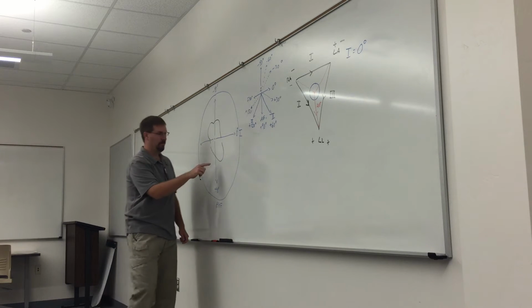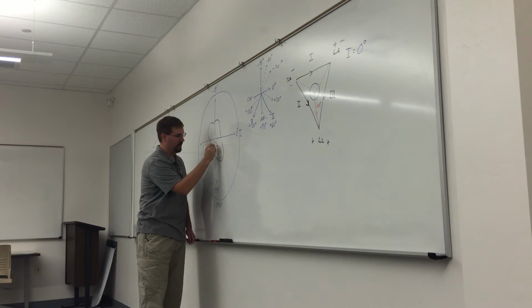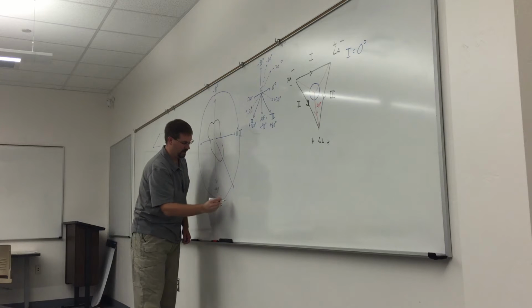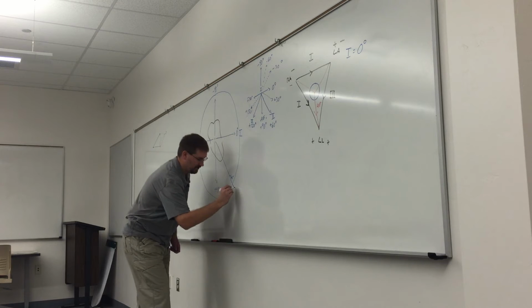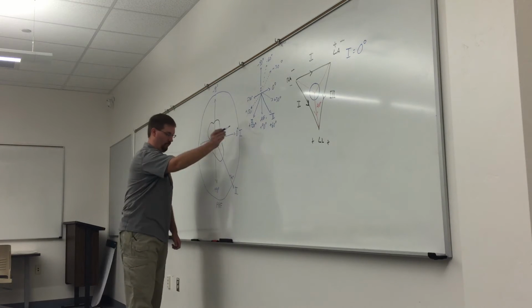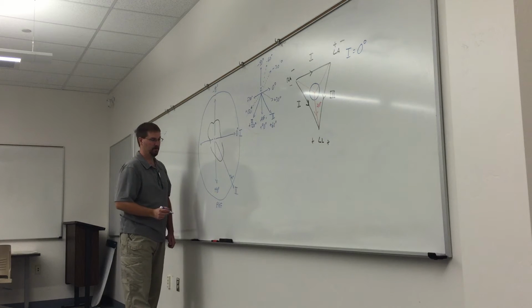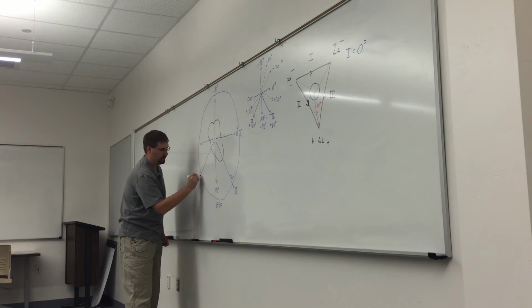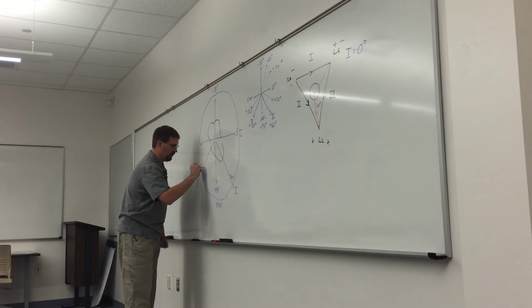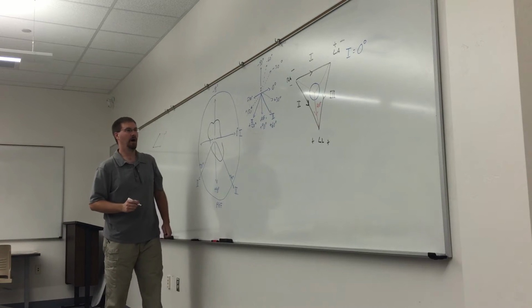Where's lead 2 here? 60. All right, so it's going to be a little closer than 90 here, so let's draw that. You guys cool with that? We're going to say that this is +60 degrees, and this is lead 2. All right, so I have 1, 2, AVF, and what's the other lead that we want to talk about a little bit? 120. Right, 120, which is going to be a reflection of this one here, and this is going to be 3. And that's 120 degrees, and I'll put positives here. Those are all positives, okay? Are you guys cool with that?